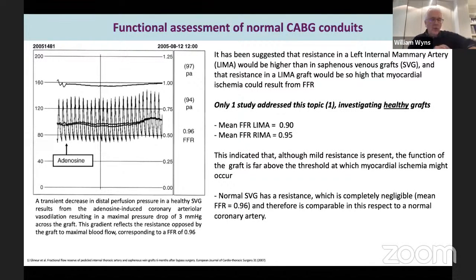We can finish in 1 minute with the bypass conduits. This slide is about LIMA and RIMA. Long vessel, okay? Not very large, particularly early after surgery. After months, it will double its volume. Is this graft an obstacle to flow? Because on average, its diameter is much smaller than the diameter of a vein graft.